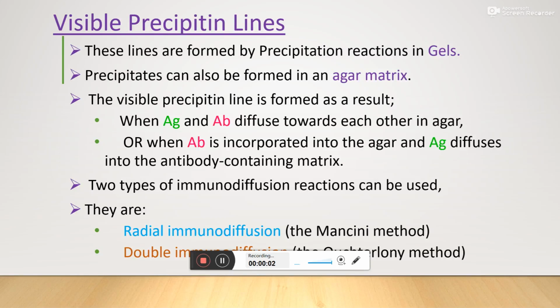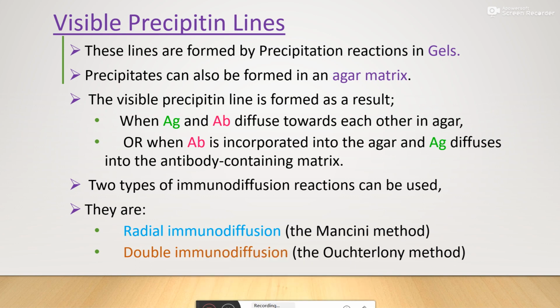Welcome back. In the earlier step, we already discussed what a precipitation reaction is and how the precipitin curve is formed. In this section, we are discussing the visible precipitin lines.